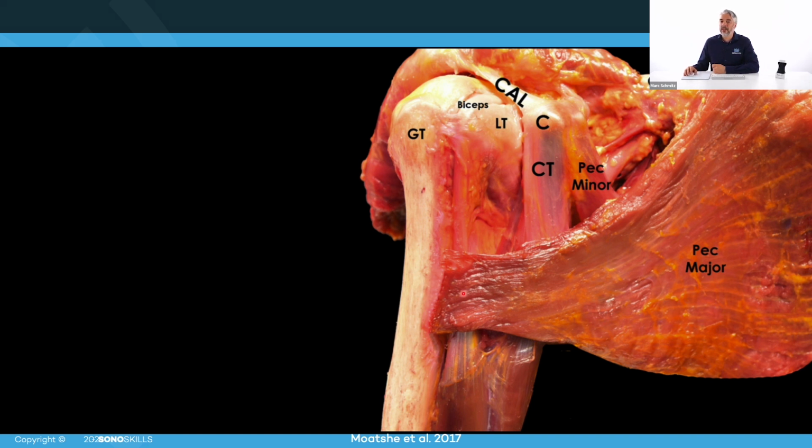Once we've checked this functionally, with external internal rotation, we can continue following the biceps to distal, looking at the musculotendinous junction and also the muscle fibers, and by creating a resistance, a flexion of the elbow joint, and making an antiflexion with resistance, you can test the biceps muscle and see whether there are some small tearing in the biceps muscle or if the musculotendinous junction is affected. So if in doubt, especially if in doubt, always ask for a biceps contraction, so that tearing and damage to the biceps muscle can be more apparent.